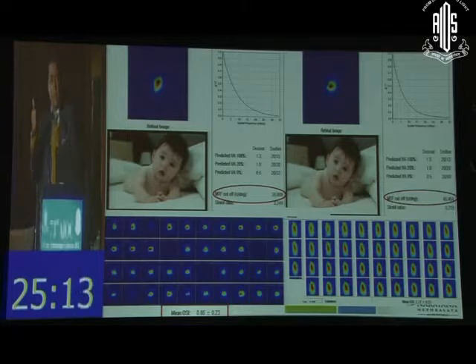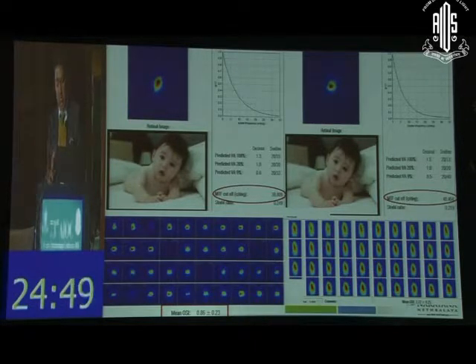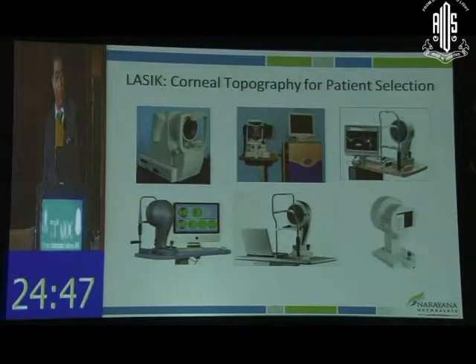You can look at the lipid layer in your tears, which is probably the most important for evaporative dry eye. It helps to look at the meibomian glands, which are necessary for the health of your tears. And the third thing is, if you want to quantify how much of your vision is actually changed because of the tear film, we have technologies to do it. So virtually at one shot, you completely understand the whole pathophysiology of the tears.